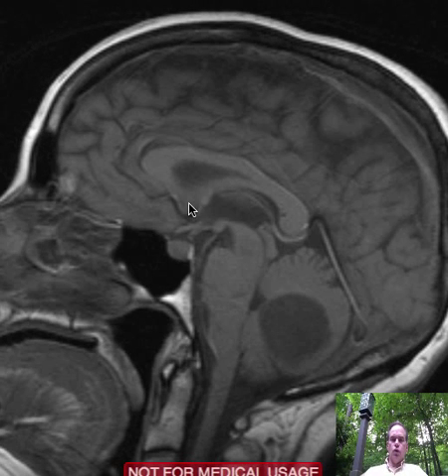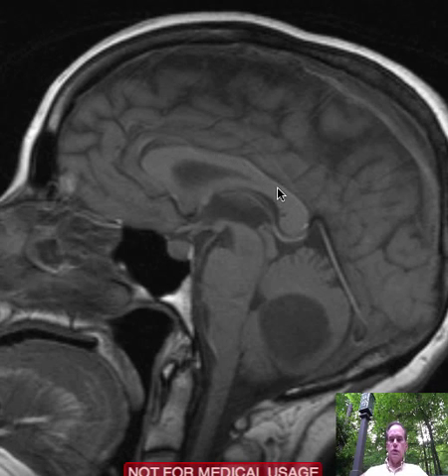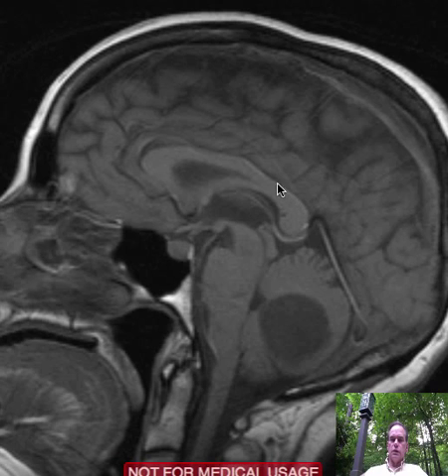Here we have the corpus callosum. We have the rostrum right here, the genu — it means knee, though we don't call it the knee of the corpus callosum. Here's the body of the corpus callosum, and here is the splenium of the corpus callosum. This is actually a structure called the fornix.